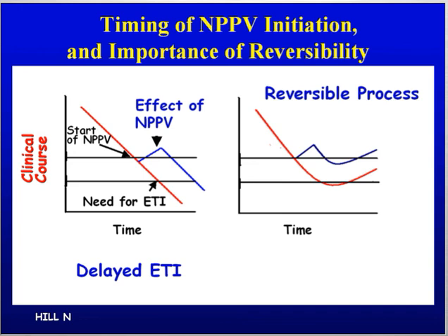I'm quite sure that one of the big risks of non-invasive ventilation is that you may have a total desynchrony between patient and ventilator, and still the ventilator looks okay, but the patient will not be correctly ventilated and will worsen. That's why I really favor very good monitoring in those patients, and I think it's really not a simple task to do non-invasive ventilation.